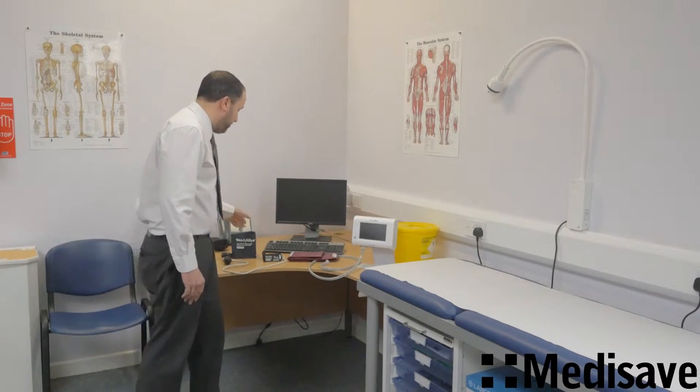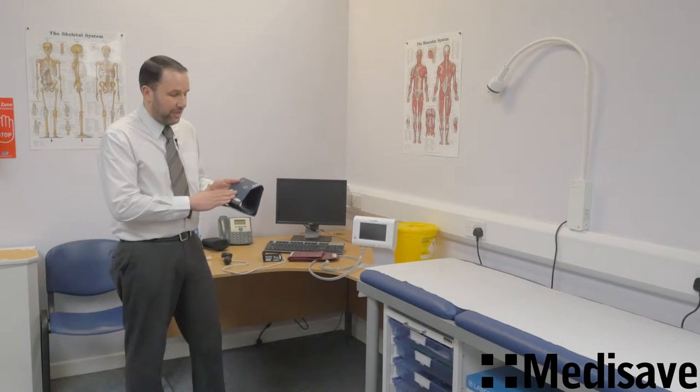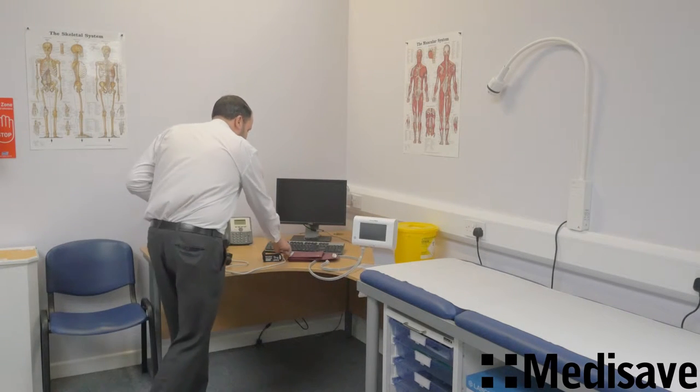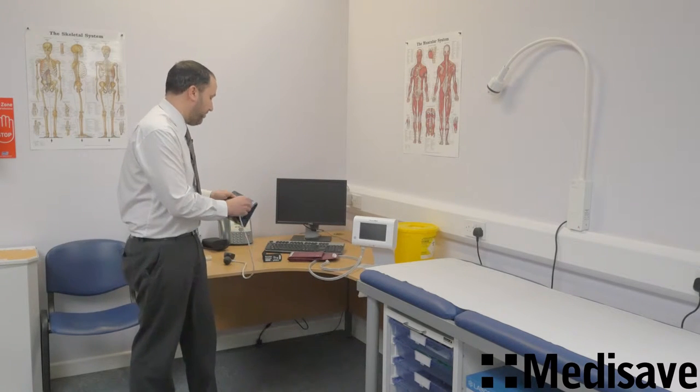The Flexport Cuff, as it sounds, is a standard cuff — the standard one here is the adult cuff. This is the Flexport part, and what happens is you get this little connector here, and to change the cuff it literally is as simple as this. That's it — just connecting on and off the actual cuff itself.